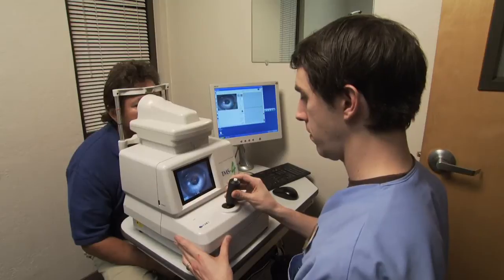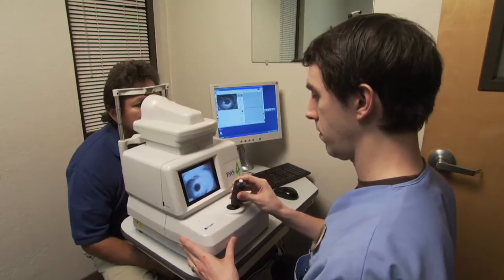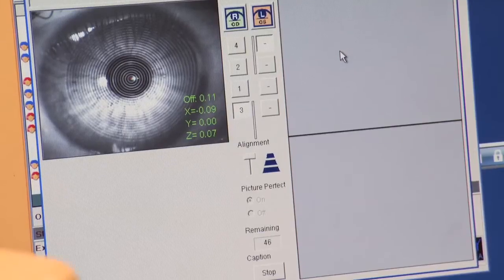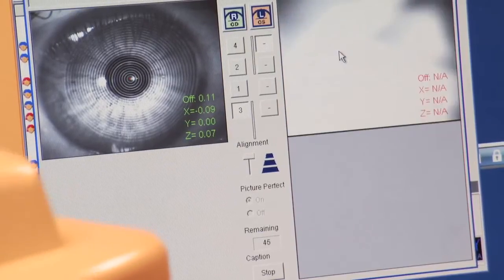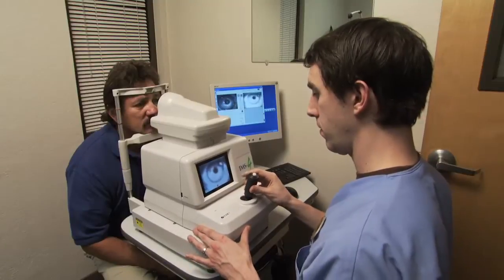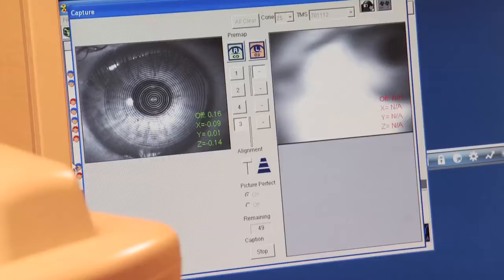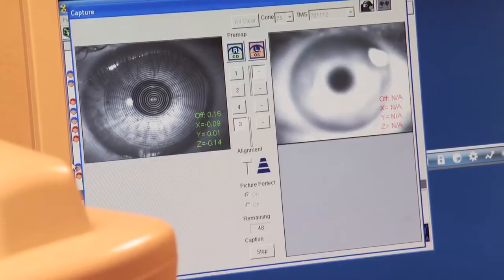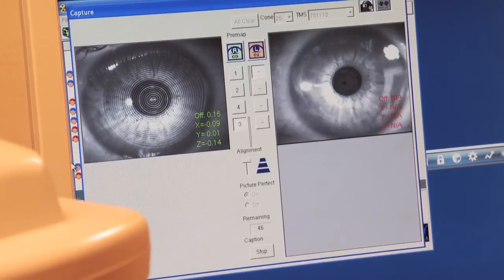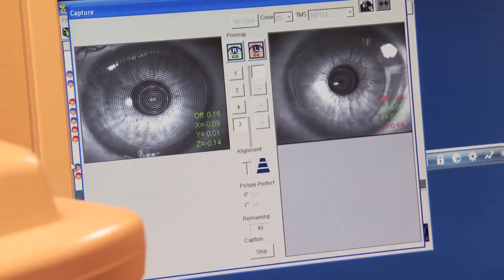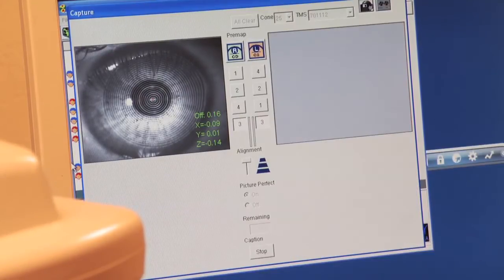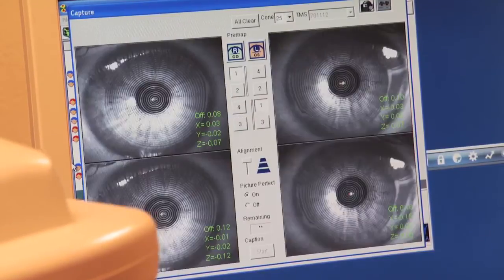When you hear a total of four beeps, the photography has been completed. Repeat the same process for the other eye. The TMS-4 will automatically select what it thinks are the best photos and place them in the boxes on the screen.